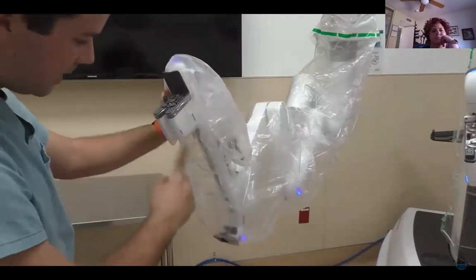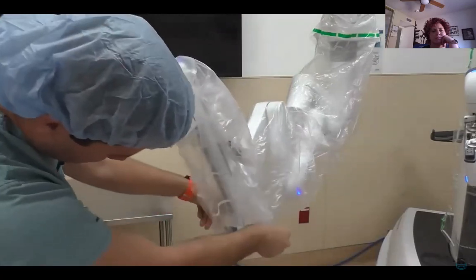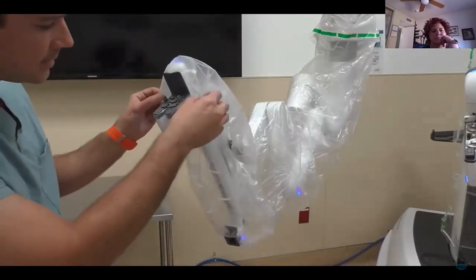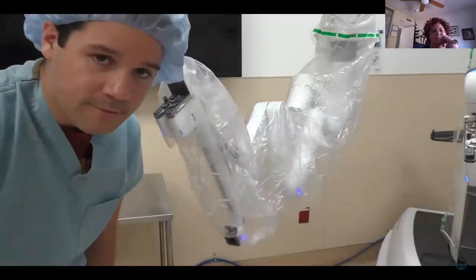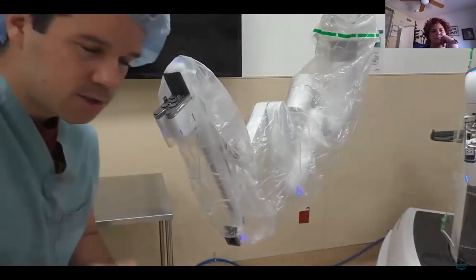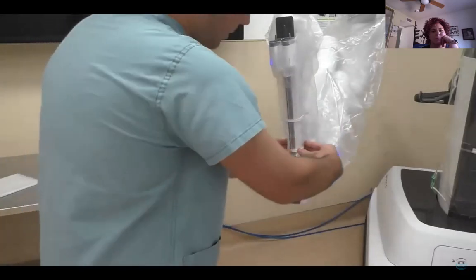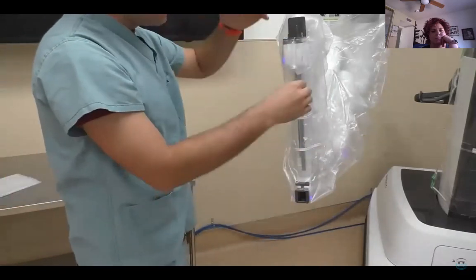And now we will attach our top plastic piece and our bottom plastic piece. It's very, very important to note that you do not get any excess drape underneath these plastic pieces. If you do, you'll probably have a fault. It won't dock right. It won't accept an instrument correctly. It's just not good. I will take these little malleable things, and I will just press them backwards to keep this drape smooth and out of the way, so it's easy to insert the instruments directly into the trocars.